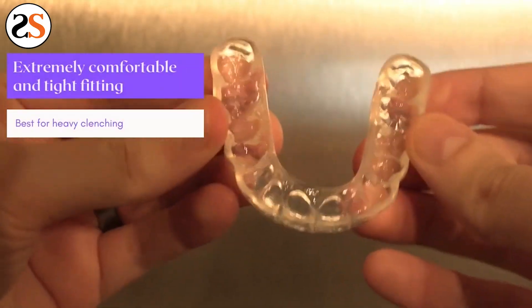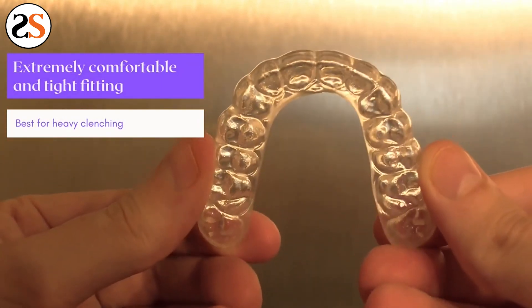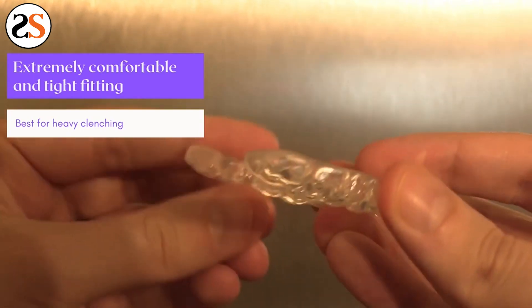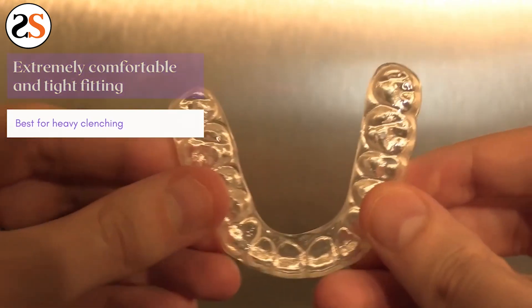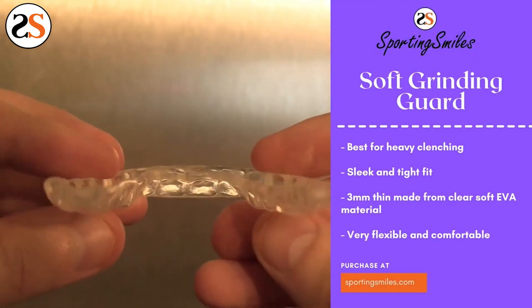Night guards are a crucial piece to protecting yourself from teeth grinding. Sporting Smiles offers six different kinds of protection depending on your symptoms. When you wear one, not only do you protect your teeth from massive damage, but you protect your wallet from the costly repairs that will come without protection.